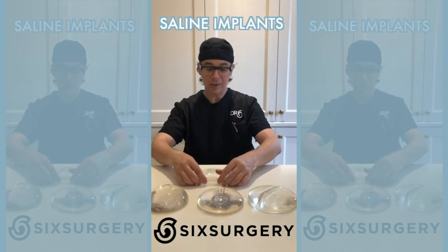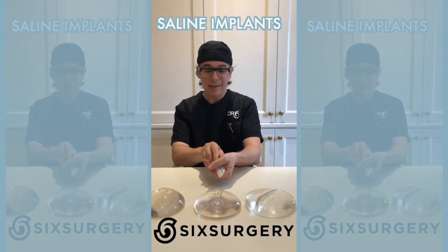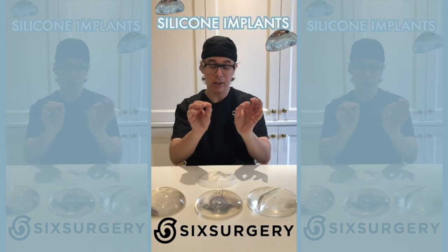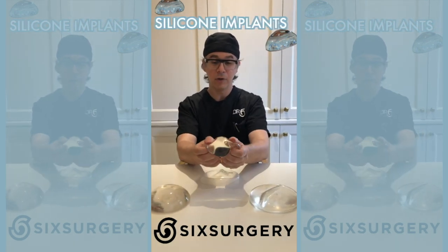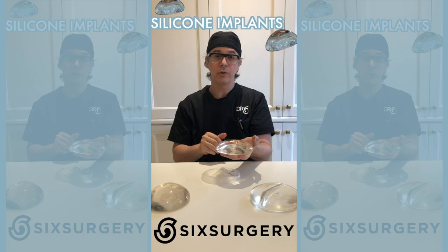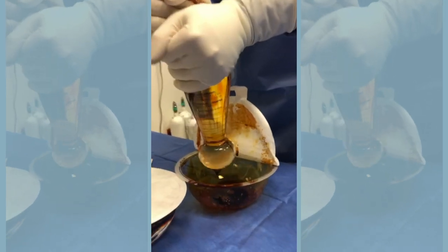Saline implants have a little port into which I put a fill tube and inject saline. So in surgery, I take this big implant, roll it up into a cigar, and slide it into a small incision. Once inside the breast space, it opens up. Silicone implants have the exact same shell but come pre-filled with medical grade silicone, so they require a bigger incision. That's why we use my tool Instaboob — a funnel device that allows me to squeeze a bigger implant through a small opening.